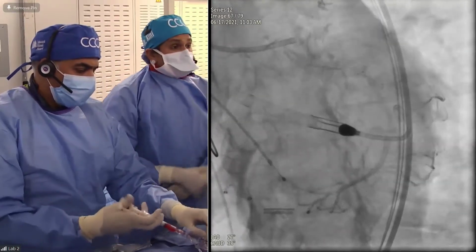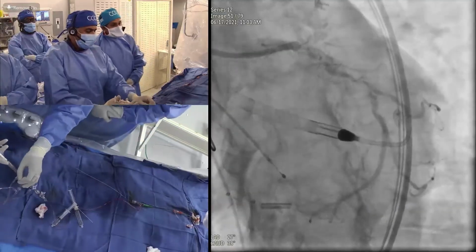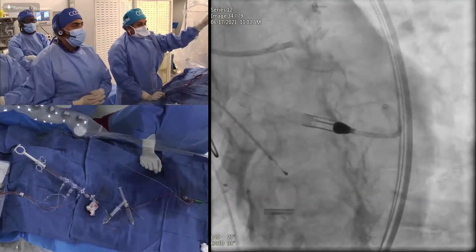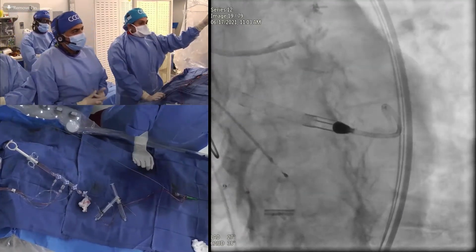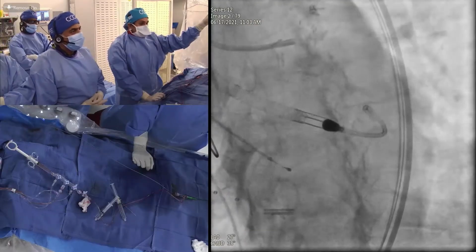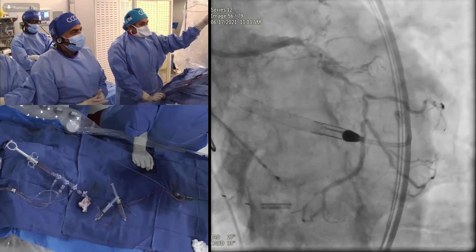So our plan is, I have a Fine Cross, and I'm going to start with the Fielder. This is what we have actually mentioned also in the app, that you will start a case like this with a Fielder. I mean, it all depends. Everybody has to probably use a polymer jacketed wire to see if we can go through this angulated calcific vessel.